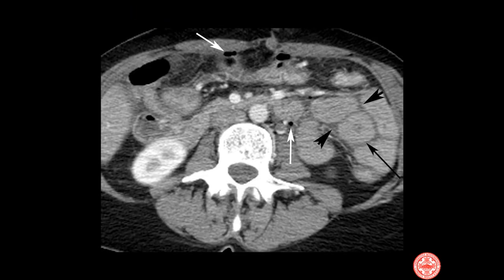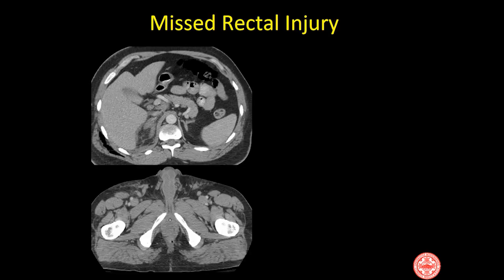Another patient with similar findings — pneumoperitoneum, thickened loops of small bowel, blood in the mesentery — all signs of bowel injury, especially when seen in combination.